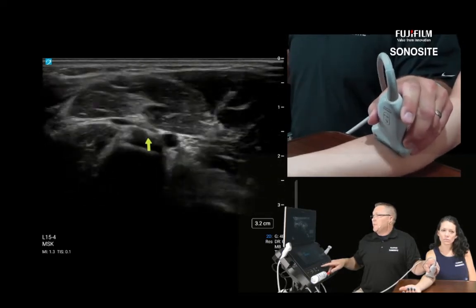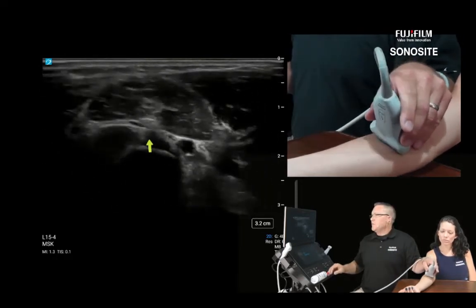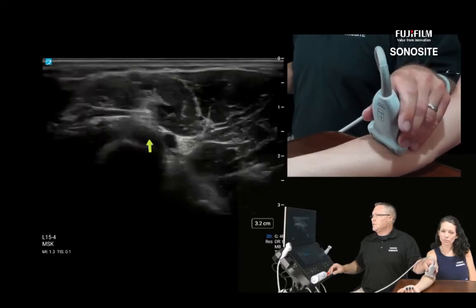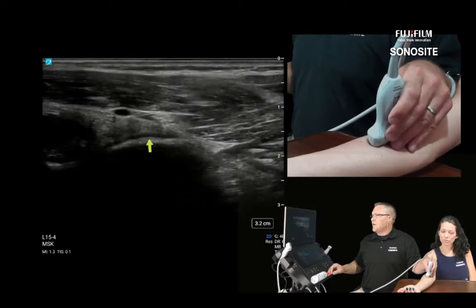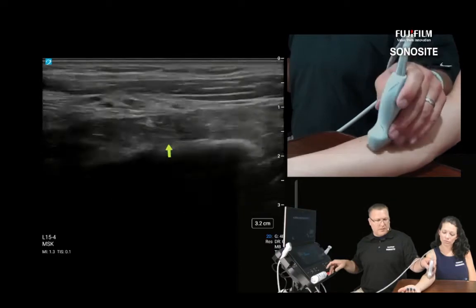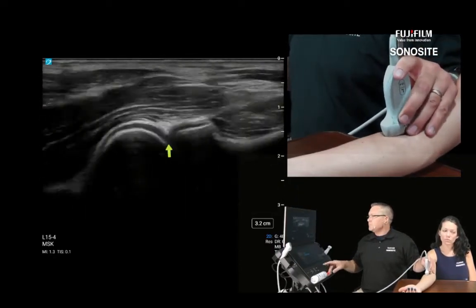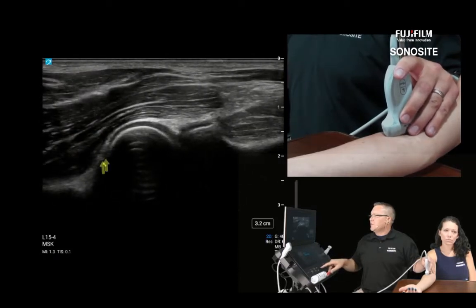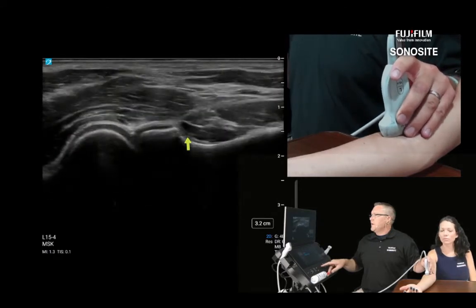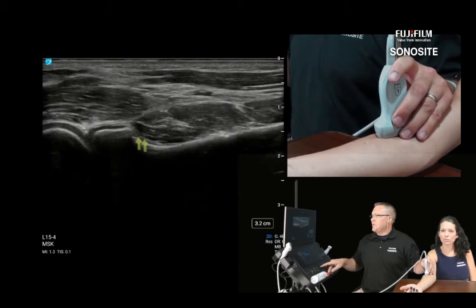It's kind of hard to pivot on because the antecubital area of the elbow tends to be very, very hard to traverse with a linear array transducer. So if I wanted to go long axis on that, I might get lucky and get the radial tuberosity in long axis. But I would just coach you to start right back over that dog bone that we started with. So here we kind of see the distal humerus and the radial fossa again. Distal radiocapitellar joint, okay, radial head and neck. And if you look at the anatomy diagrams, we don't see the radial tuberosity anywhere over here.